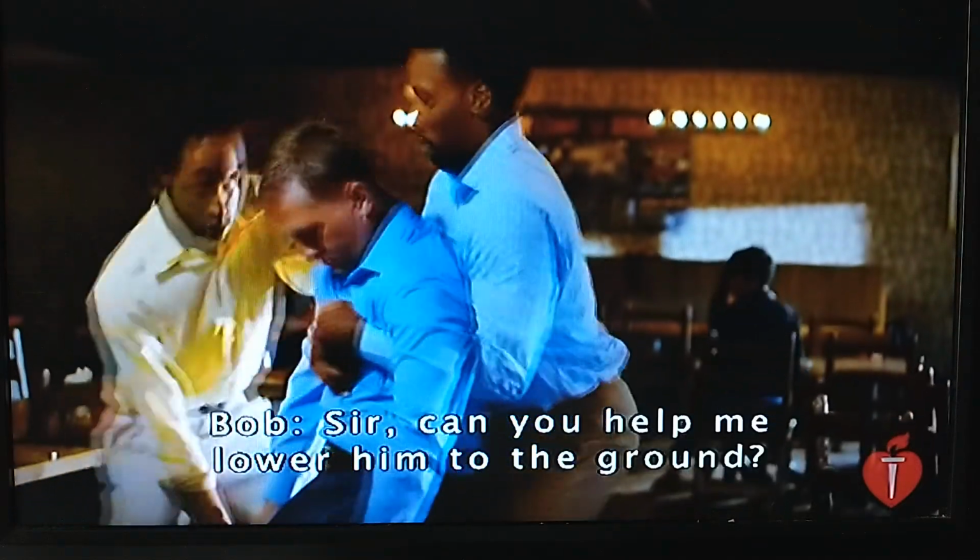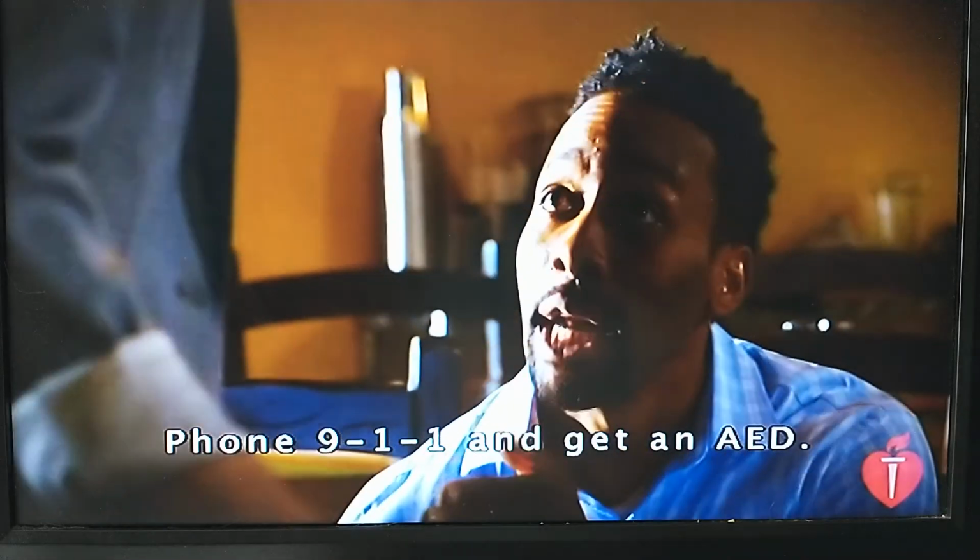Sir, can you help me lower him to the ground? Phone 911 and get an AED.